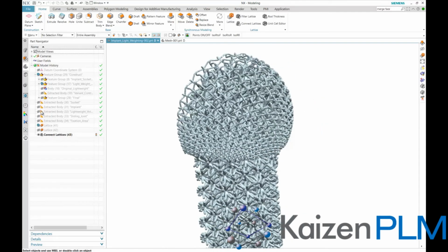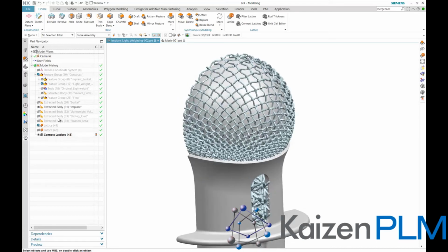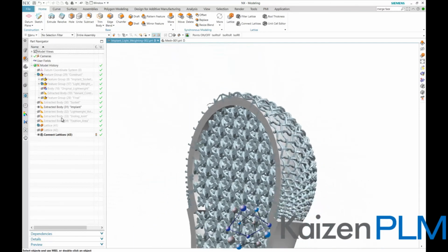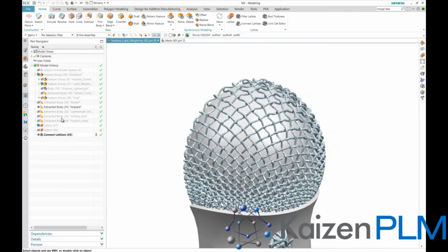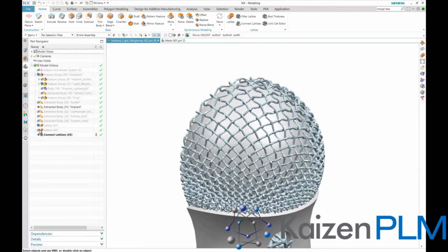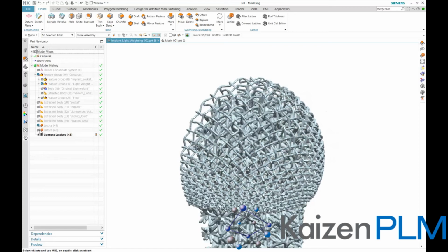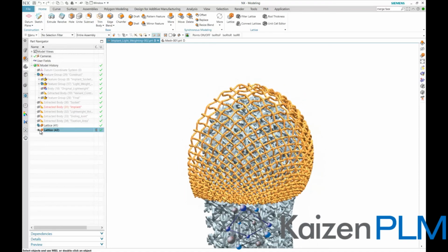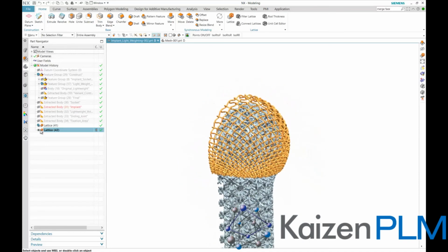Reviewing the connected lattice together with the implant shows that it would work perfectly should the implant be polymeric and not hollow. However, since the lattice structure is intended to lightweight the metal implant and be merged with the same, the connections between them are not needed, and therefore we return to the previous state by undo.